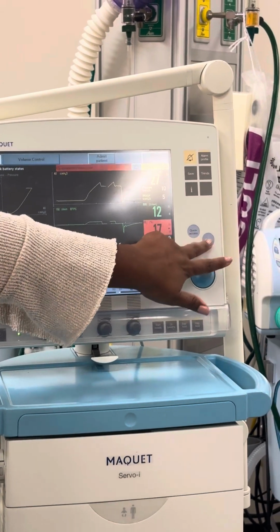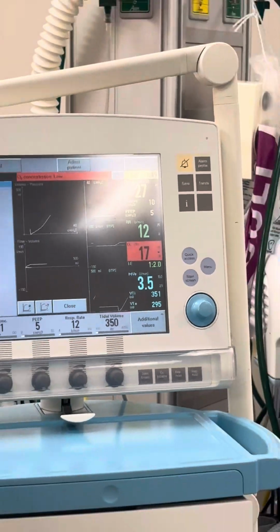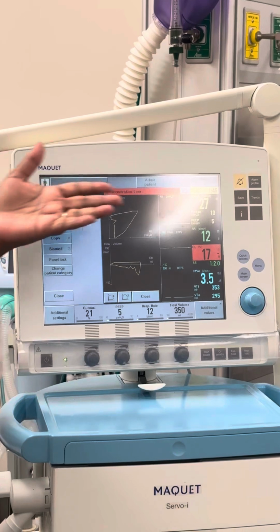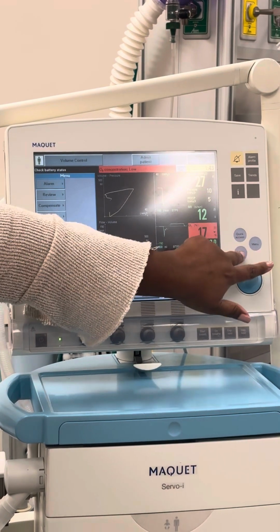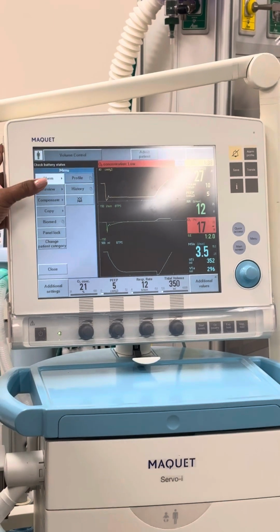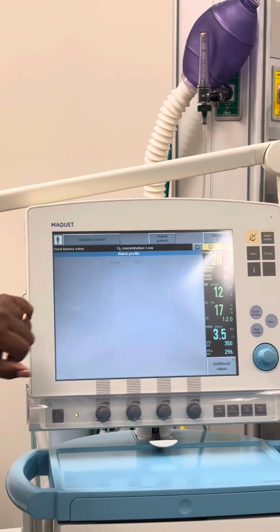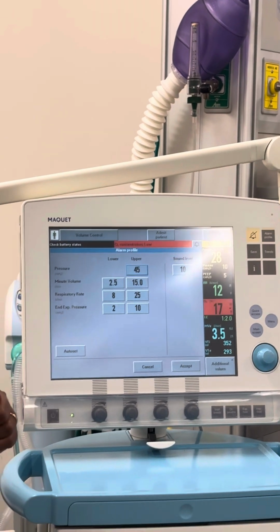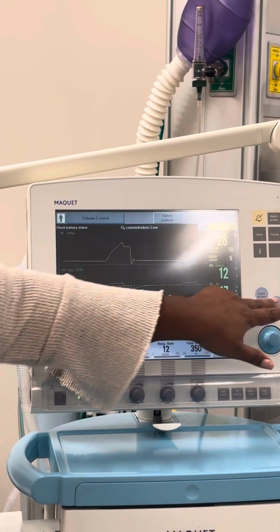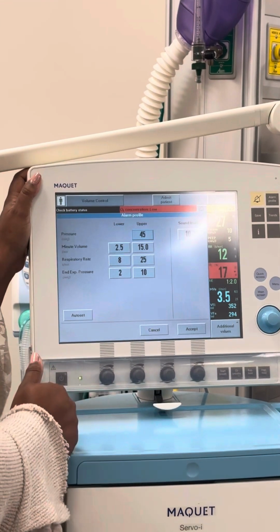Yeah. And the menu just takes you back to the main menu, obviously. If you don't want to hit the alarm panel for your alarms, which is quicker, you can actually hit menu and hit alarm, hit profile, and it'll come up, which is quicker. Where it says alarm profile. You can get to alarm profile from here. You just have to go through several different buttons to get to it.